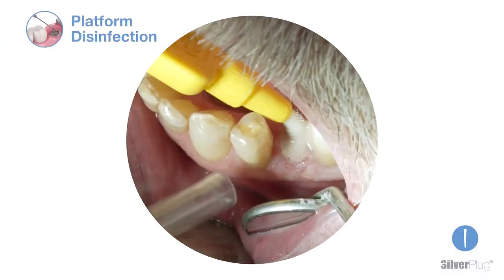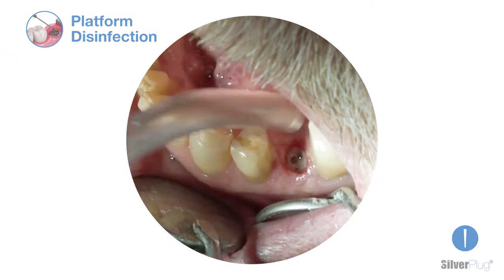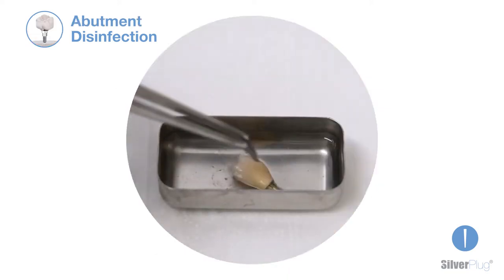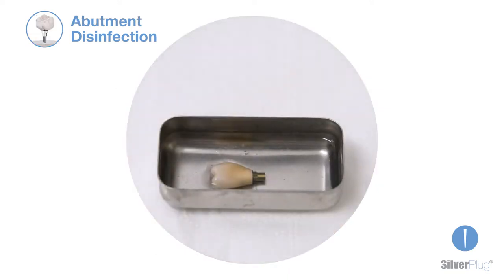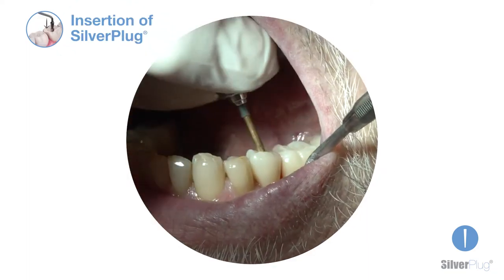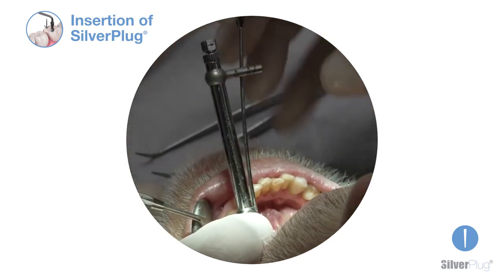Clean the implant platform with an appropriate product and remove the biofilm with a cylindrical brush. The secondary component needs to be disinfected and rinsed thoroughly with a sterile saline solution too. Fit the implant prosthesis and torque the prosthetic screw appropriately.